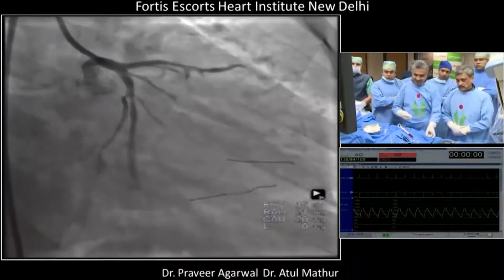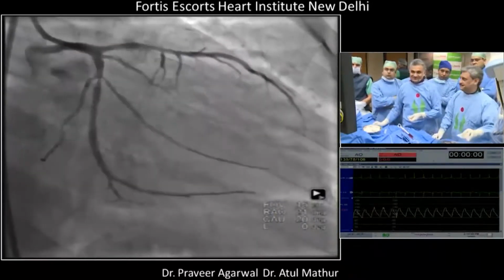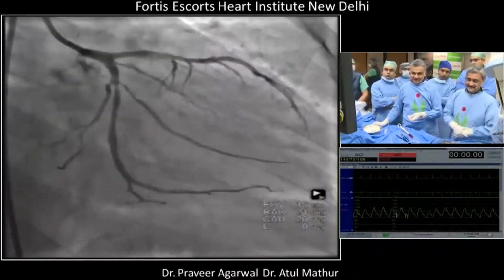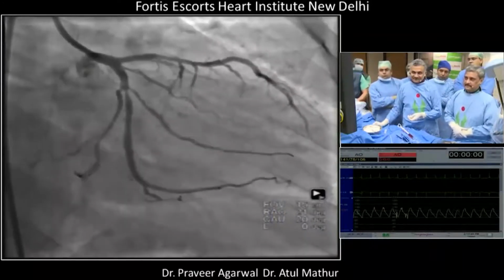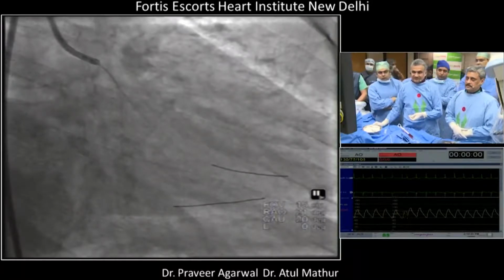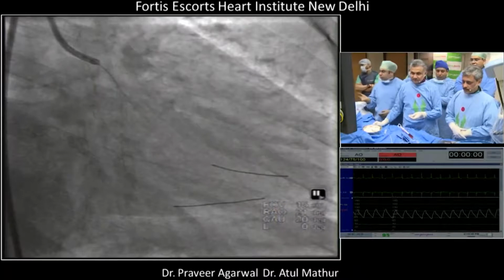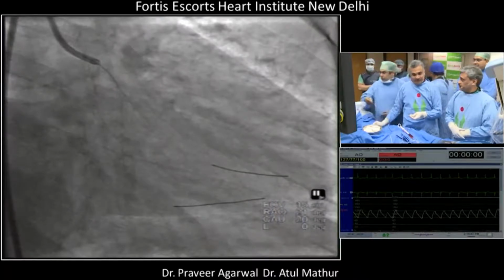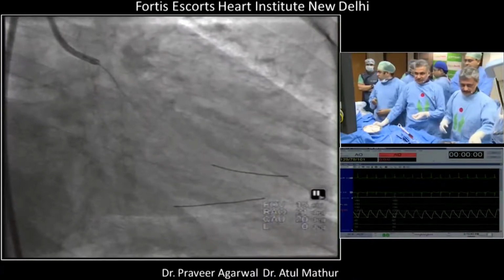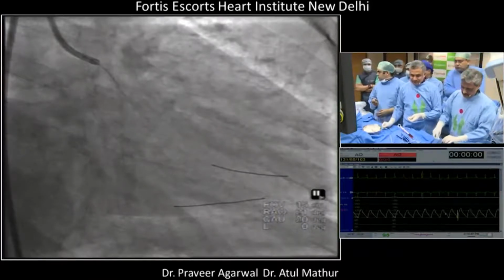V-stenting is only one person, Atul, I think, because even I feel that you have to do an IVUS to show that there is no plaque completely in the proximal circumflex. Most people feel that if there is disease in the two branches, there's also disease in the main vessel. Okay. So DK crush or provisional stent strategy: maybe I would say 60% DK, 40% provisional. Surprisingly, actually, I would go provisional.